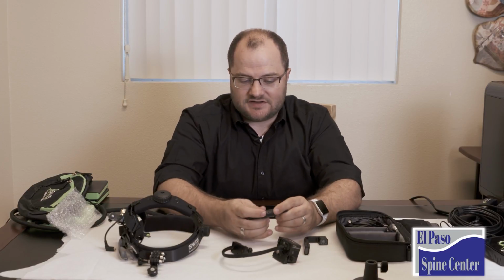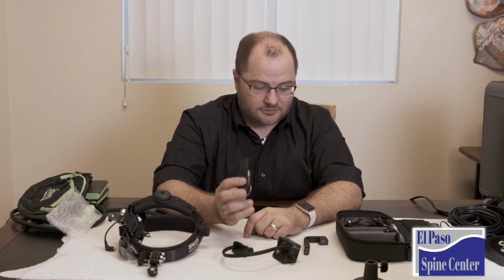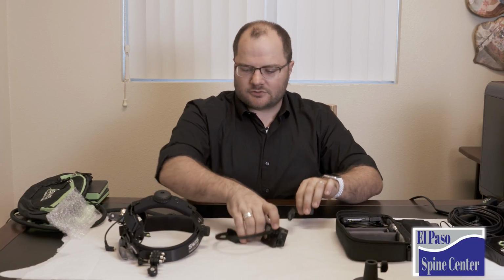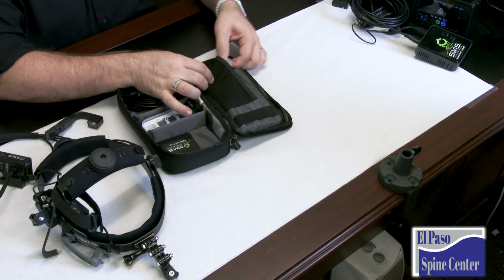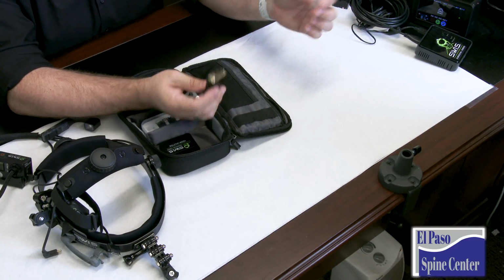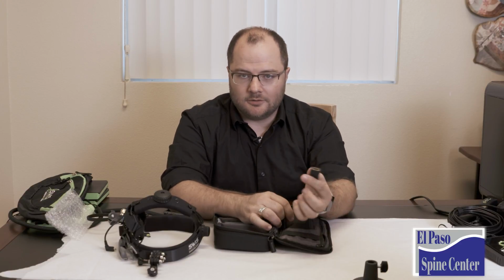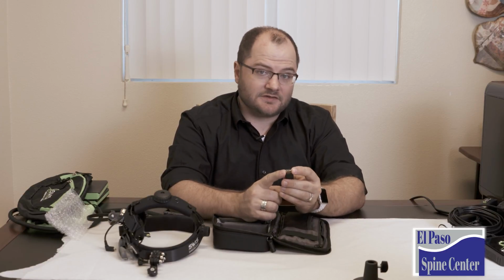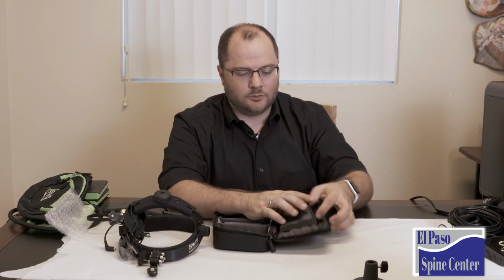When I first got it, it was attached with an HDMI female-to-female adapter, we are going to be using that, so don't lose that. But I'm going to set that over here for now. The other things you're going to find in this case, there is an HDMI to DVI adapter if you want to have your HDMI feed go to a monitor. There's also another female-to-female HDMI adapter, and there's also a mini HDMI to full-size HDMI, which we are going to be using. I'm going to leave that in here for the moment so you can come back to it and we know where it is.